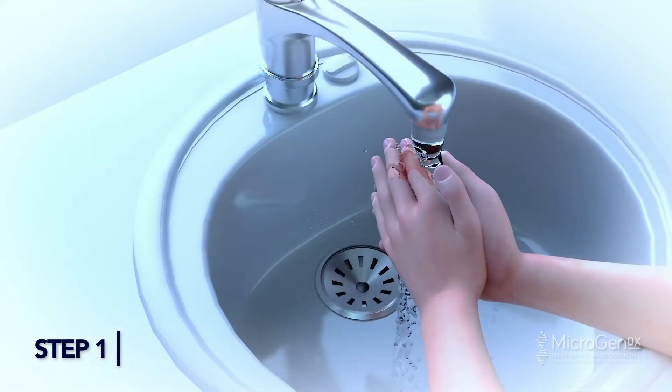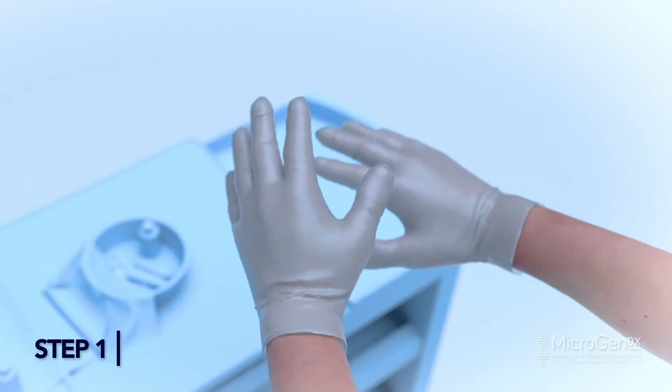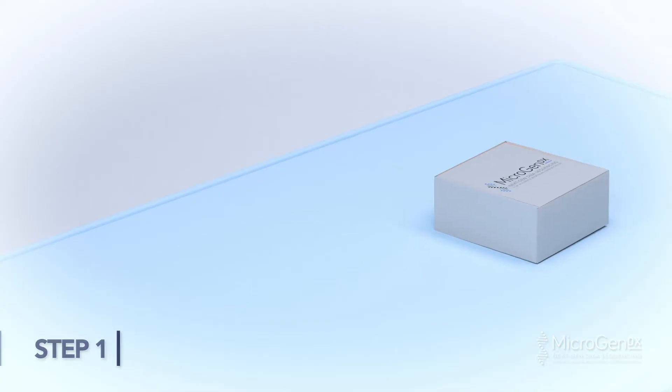Step 1. Wash your hands thoroughly with soap and water. Put on gloves and mask after cleansing and drying.